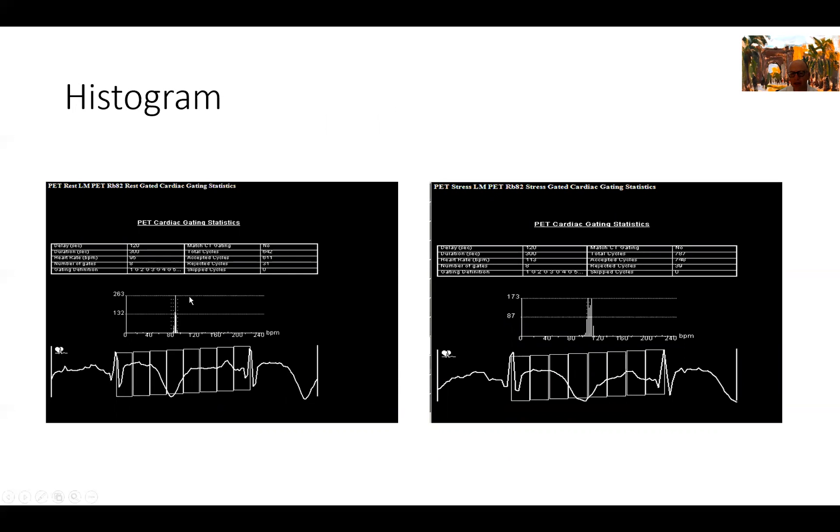Then the next step is to look at the gated images. So before we do that, we interrogate the acquisition part of it. These are the rest images on this side. The heart rate was 95, with a beautifully tight histogram here for the heart rate. In the stress images, this patient's heart rate jumped up to 113. This is not unusual. This patient has stopped his beta blockers for whatever reason when he came to the stress lab. This is a pharmacological stress test, but he was tachycardic at rest and more tachycardic post-pharmacological stress testing with adenosine. You can see here his heart rate was 113 with a nice tight histogram.